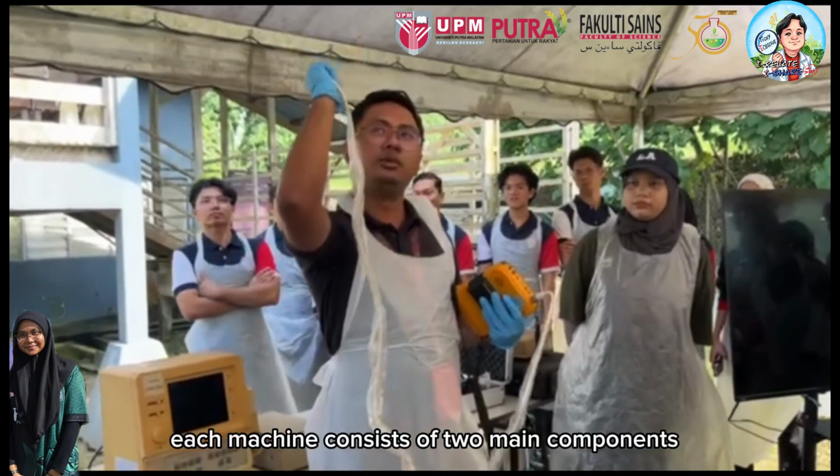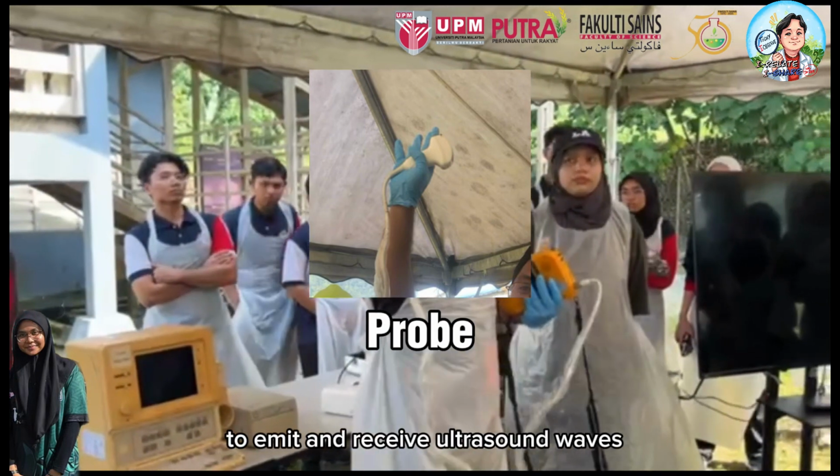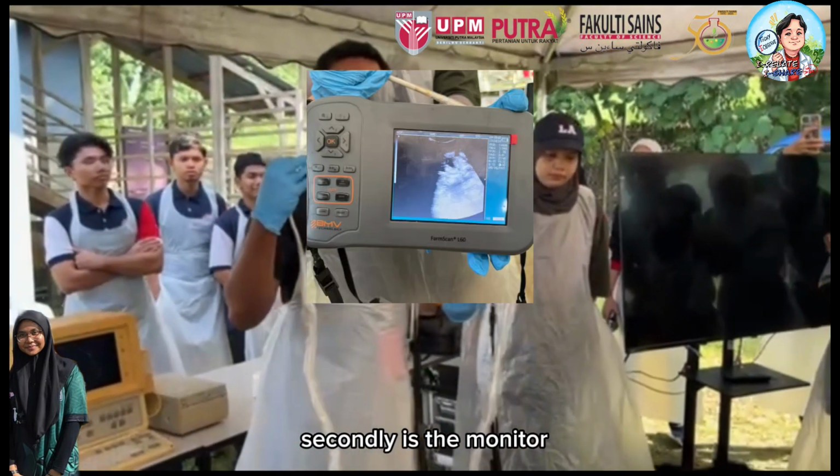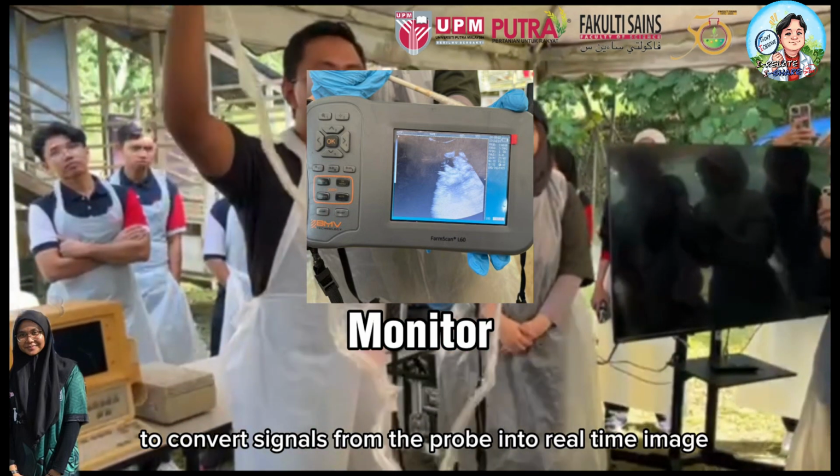Each machine consists of two main components, which is first the probe or transducer to emit and receive ultrasound waves. Secondly is the monitor or display screen to convert signals from the probe into a real-time image.